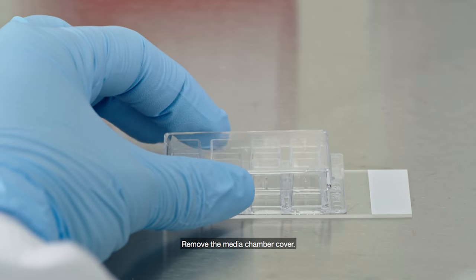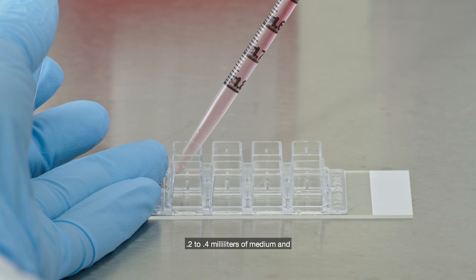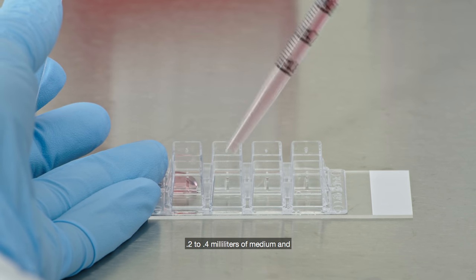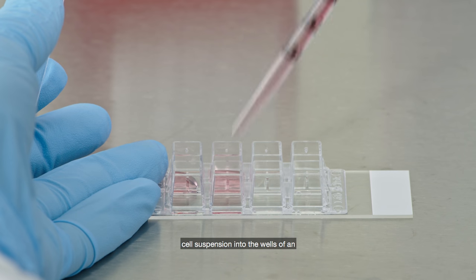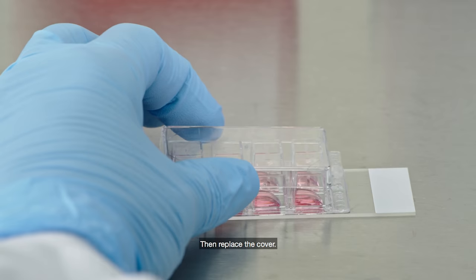Remove the media chamber cover. Using a serological pipette, fill the chamber with 0.2 to 0.4 milliliters of medium and cell suspension into the wells of an eight-well chamber slide. Then replace the cover.